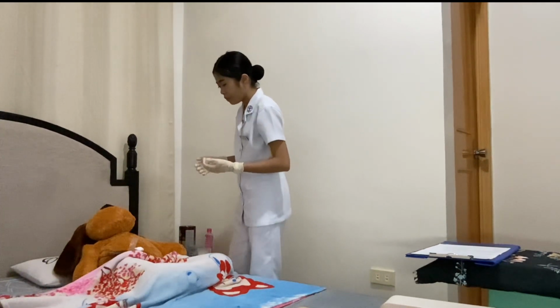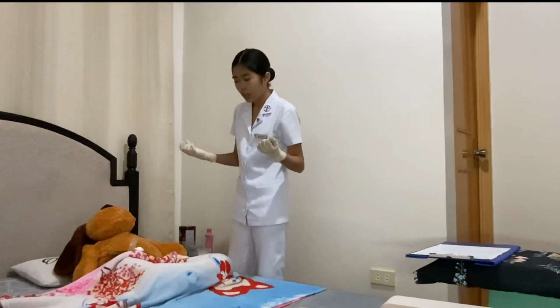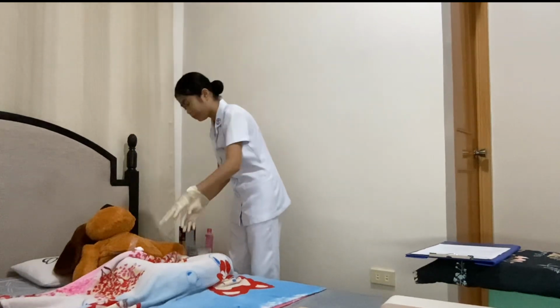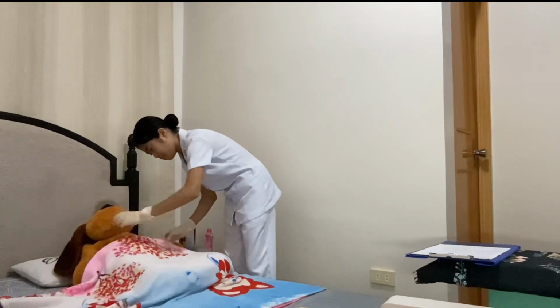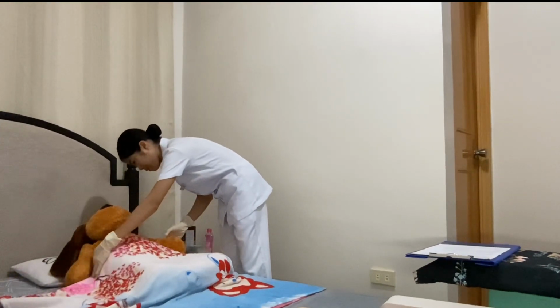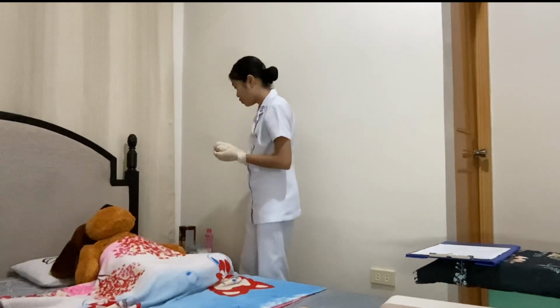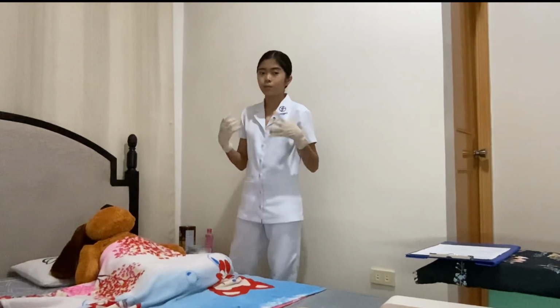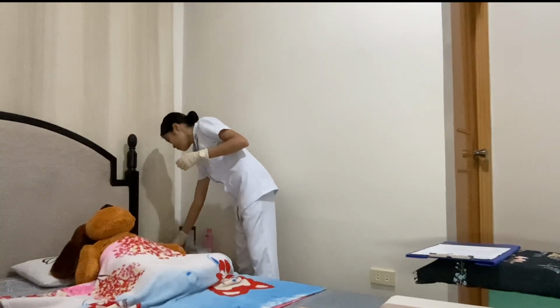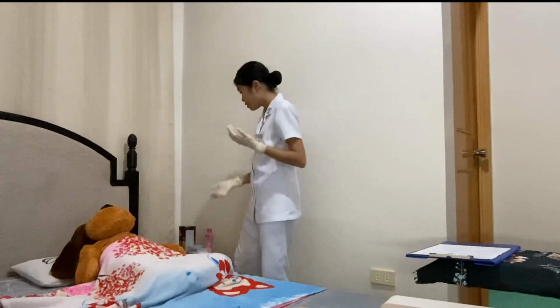Okay. So, ma'am, since I have already administered the medication to the patient, I'm going to pull back the blanket that I pulled down on her to expose the adipose tissue, the abdomen area. And what we're going to do next is to dispose of the materials used. I'm going to dispose of this. And then what you're going to do is the aftercare of the materials that were used.